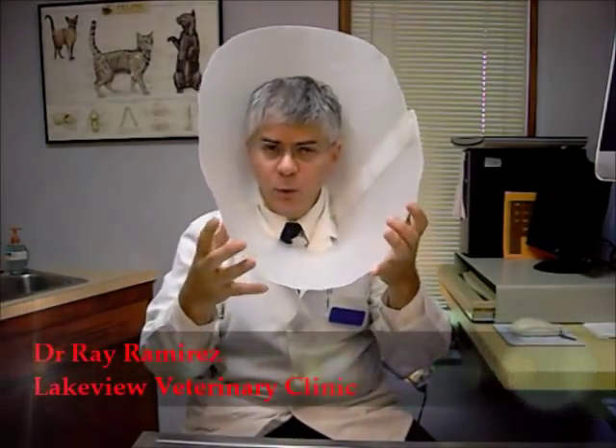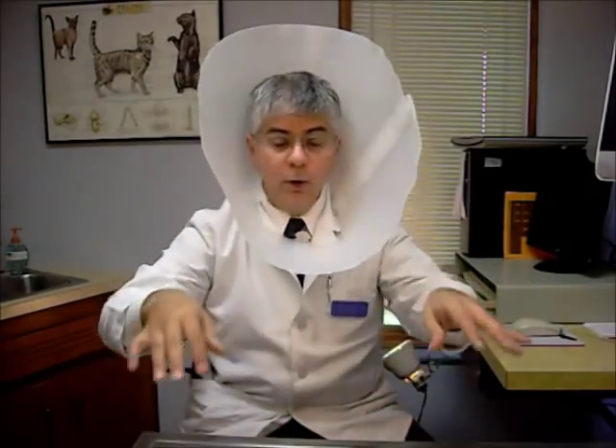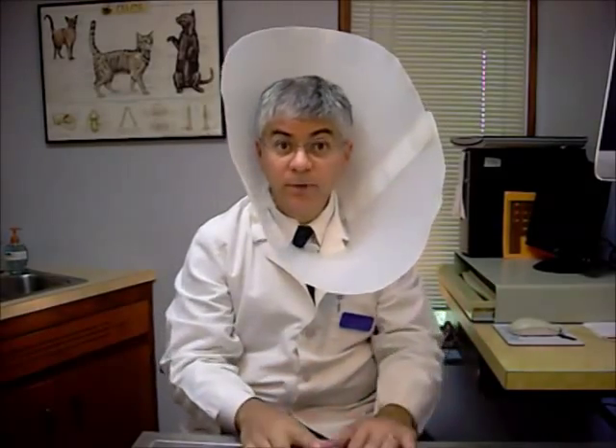So you're saying, why is Dr. Ramirez wearing the cone of shame here? It's to demonstrate what you need to do to help your pet. Why do we even have one of these things? It's to keep them from licking at their paw, back legs, tail, or something on their body — either after surgery or because there's a growth we need them to leave alone so it can heal. So we put one of these cones of shame, or in the medical field, an Elizabethan collar, around them.